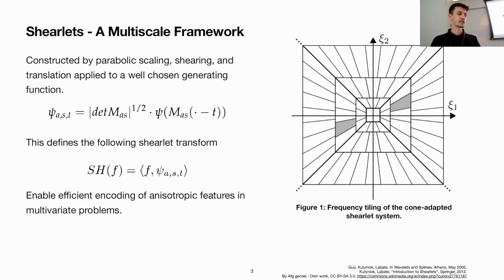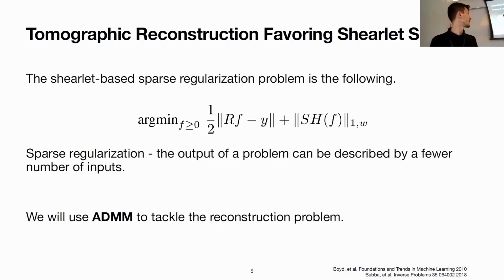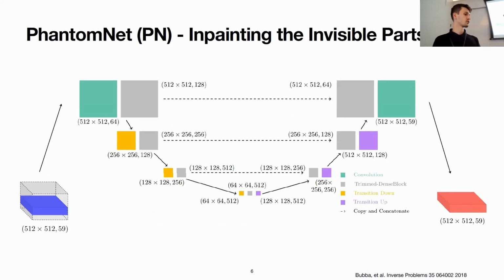One reason for that is that if you are going to do inference or training through deep learning of certain signals, you might get very good results during a phase, for example training, but then you won't be certain how much your model will change the signal, for example in production. You'll give it an input in the spatial domain, a slice, but you won't be extremely certain how much that will change in the end.